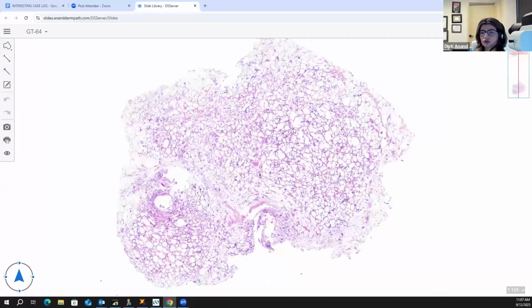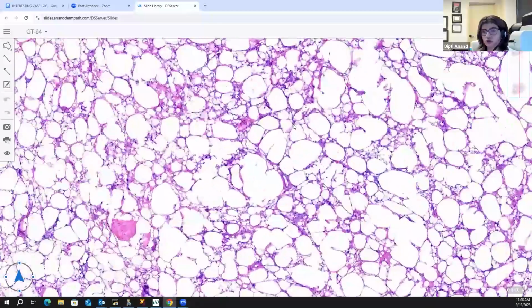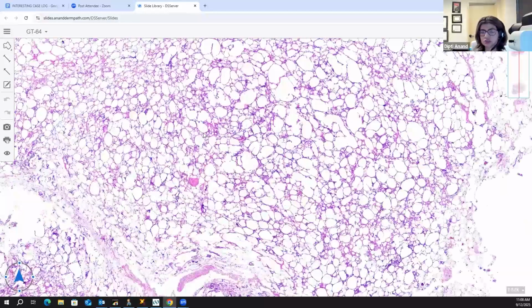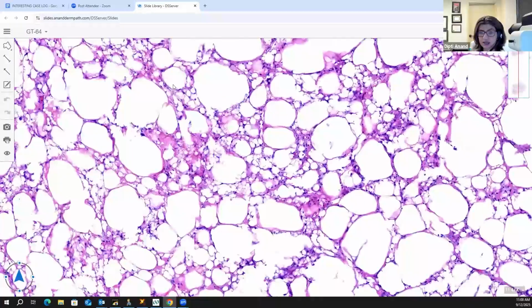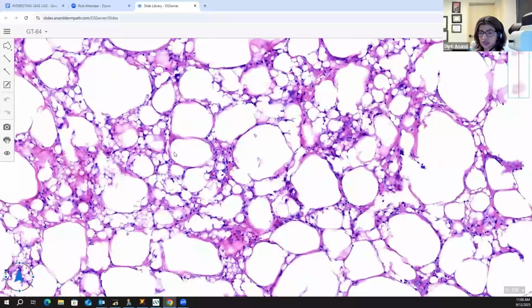And we'll talk about this later as well when we talk about foreign bodies and stuff. So a silicone granuloma produces a pseudo fat appearance. So the differential that they like to ask you in your boards, they will put things like a liposarcoma in there because you may mimic these for lipoblasts. But each of these actually contains silicone in it, and it has dissolved, leaving behind these empty spaces.